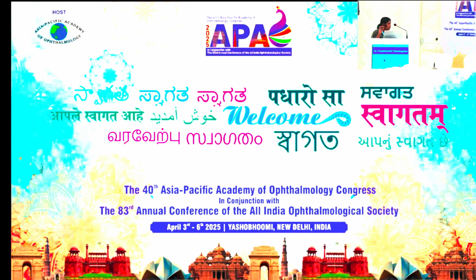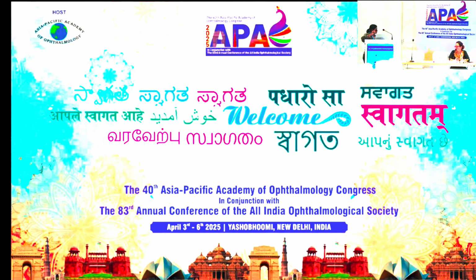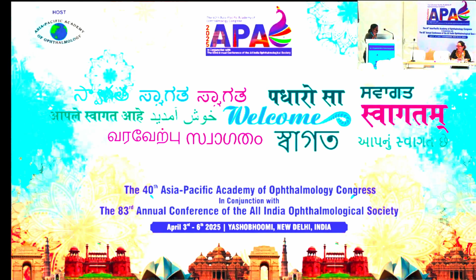Thank you. So, in that first case, you diagnosed it as grade 4 hypertensive retinopathy. What were the points in favor of the diagnosis? Her BP was high, ma'am, 180/120, and there was disc edema and splinter hemorrhages. In that fundus photo which you showed us, only disc edema was visible. There were no soft exudates, no flame-shaped hemorrhages. You did a macular OCT and there was no edema also. So how did you come to that diagnosis?